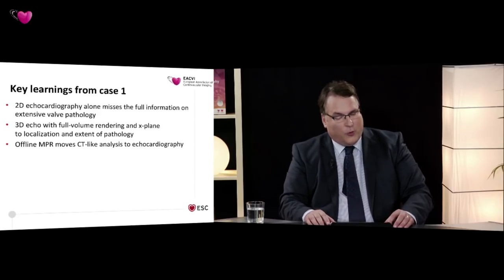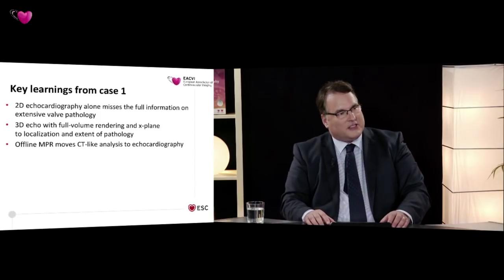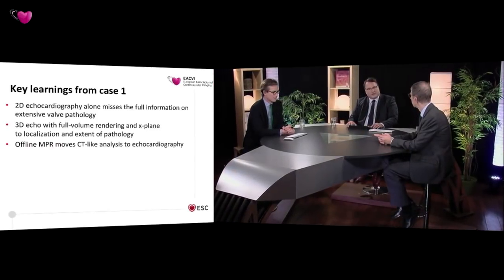After all, who will receive benefits from MitraClip? And I think for degenerative disease, this answer is already given. Could you elucidate a little bit on that? You were in the core lab also for MITRA-FR, I think.